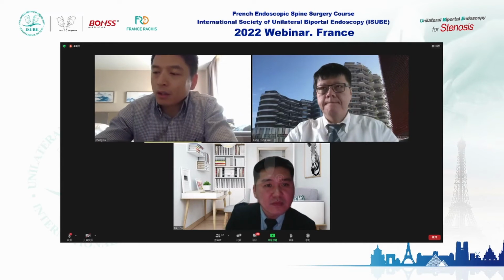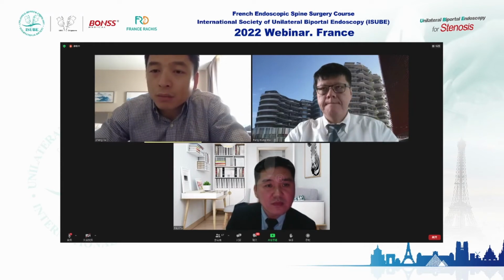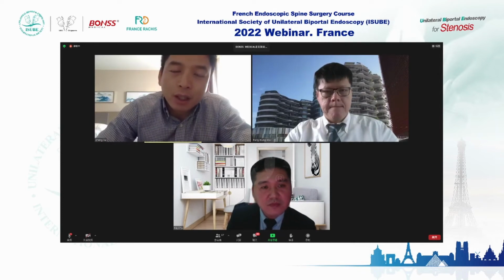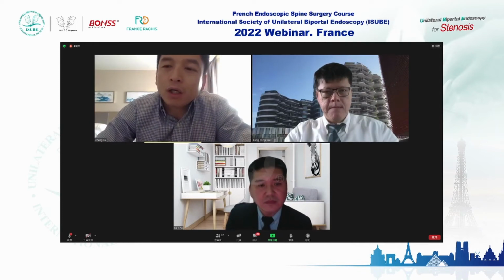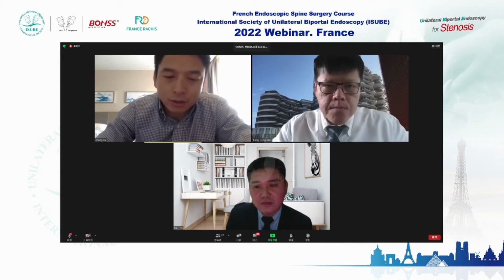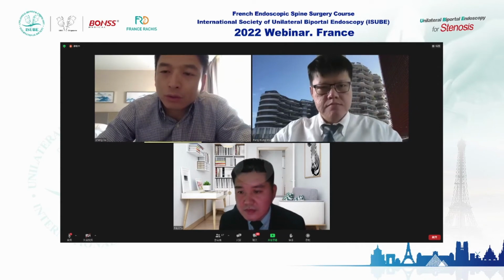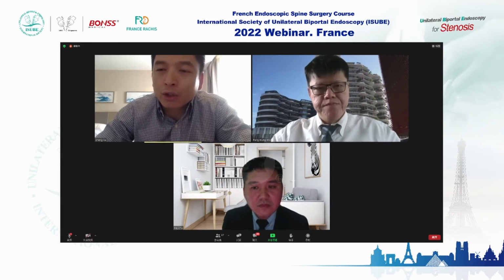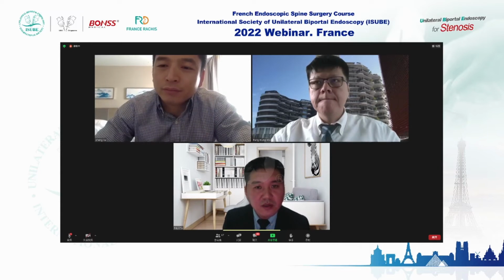I have some complications with UBE surgery. I have 2 cases of rupture of the dural matter. 2 cases, and I have 2 cases of inadequate removal of herniation of discs. How about Dr. Wu?